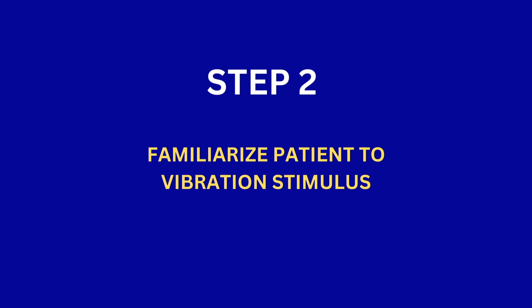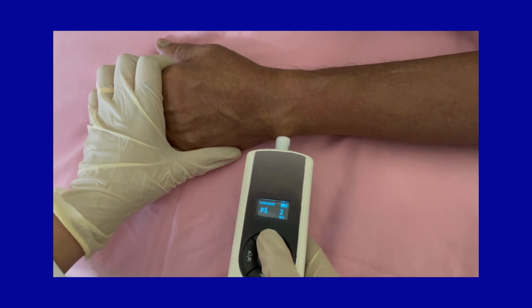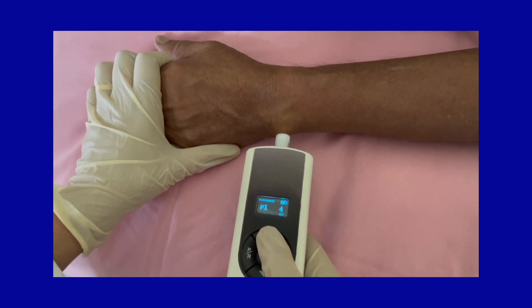Step 2: Familiarize the patient to the vibration stimulus. Apply the vibration probe to a bony prominence in the upper limb and increase the vibration stimulus until the subject feels the buzzing sensation. Inform the subject to say yes or show a thumbs up sign when they feel a similar buzzing sensation in the feet being tested.